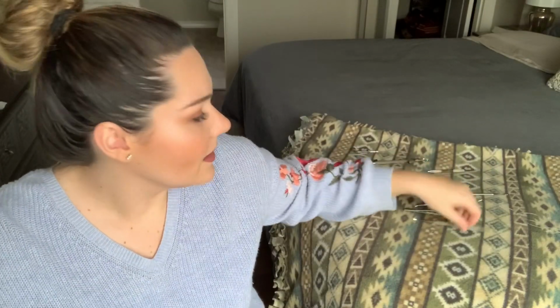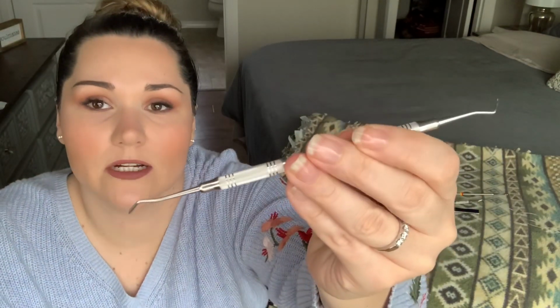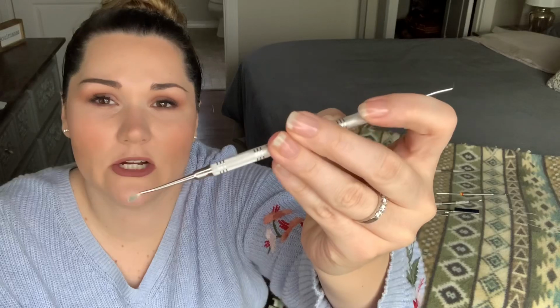And then I hand him the carver. So the carver, again, is going to be scraping the excess amalgam. So again, your suction needs to be in there because you need to be catching the amalgam. You don't want the patient to be swallowing the amalgam. So he's going to be scraping.